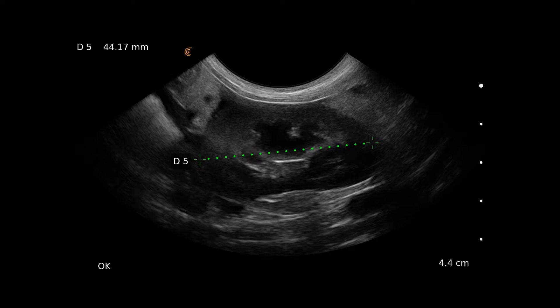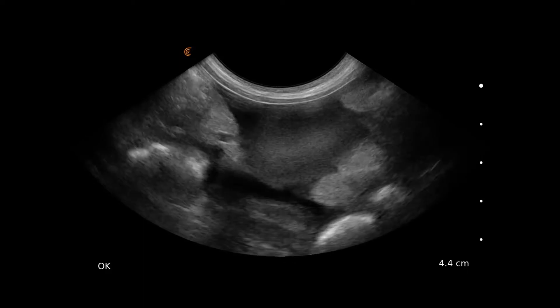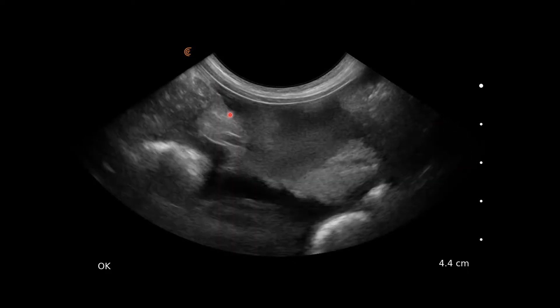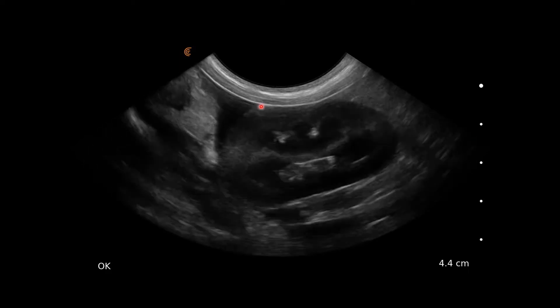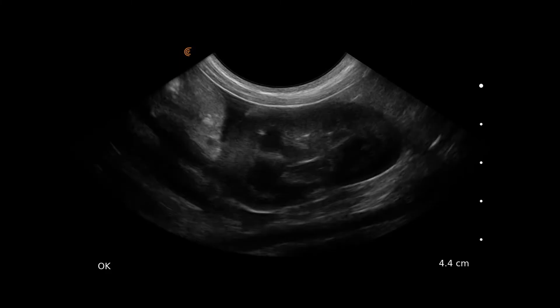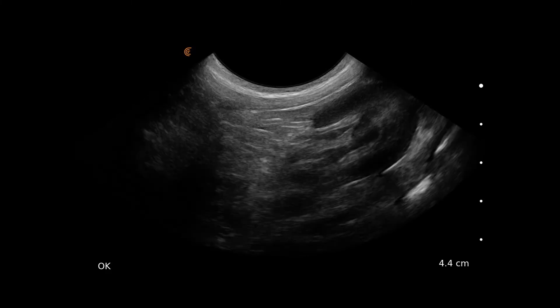The left kidney is seen here. The cortex and medulla are visible, along with the peripelvic tissue, measuring the length at 4.4 centimetres. Fanning all the way through, we can see little pockets of free fluid around here too — there's a large triangular anechoic content which is free fluid. Here we have the left kidney in transverse, showing the cortex, medulla, and pelvis area.